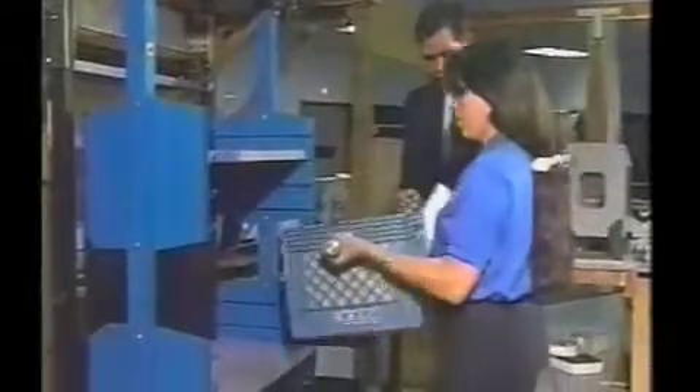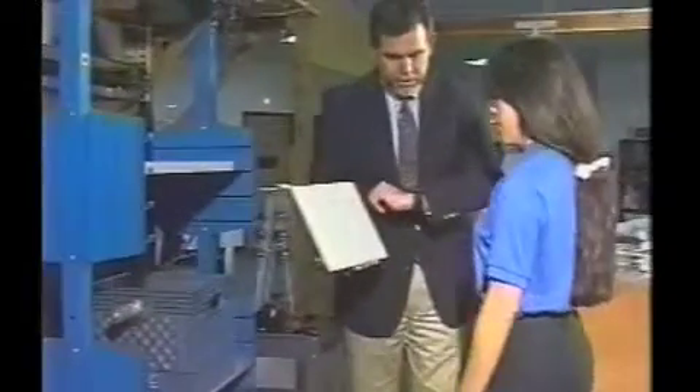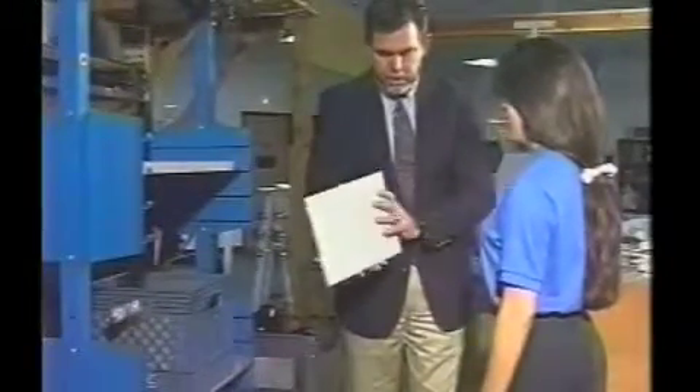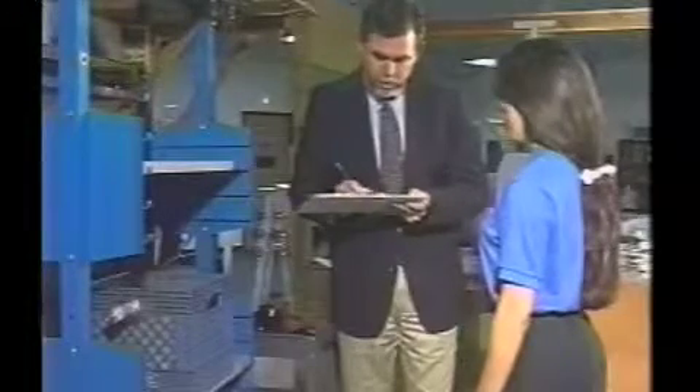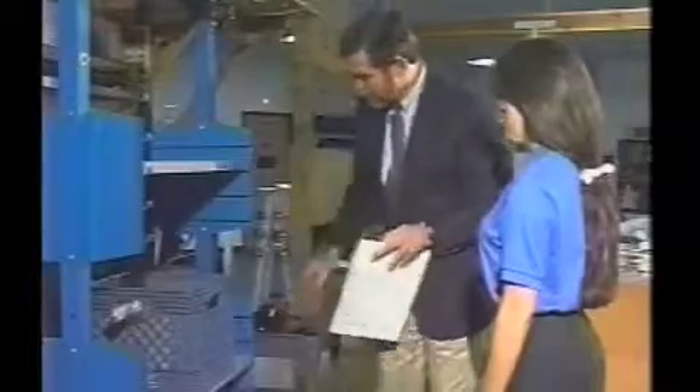Let's go ahead and try that again. And back down again. Would you rate that for me, please? Is that something you can do on a safe and dependable basis 8 to 12 times a day? [Margaret: Yes.] Can you handle more weight? [Margaret: Yes.] All right, let's try that.